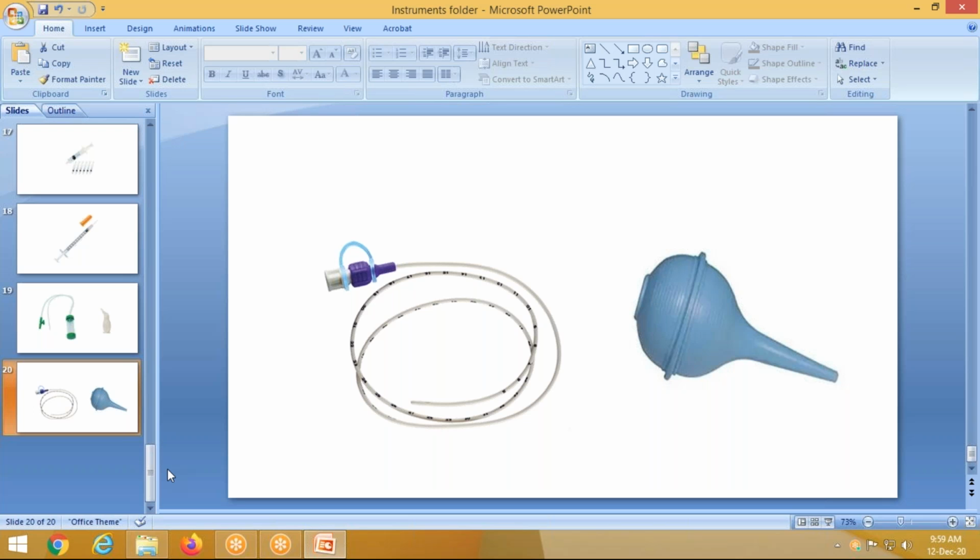And what else is expected is a feeding bottle. The disadvantages of the feeding bottle are, you can introduce sepsis through the feeding bottle. The nipple has a narrow space and infections are common. And also colics are expected with a feeding bottle. So these are the instruments we regularly keep.